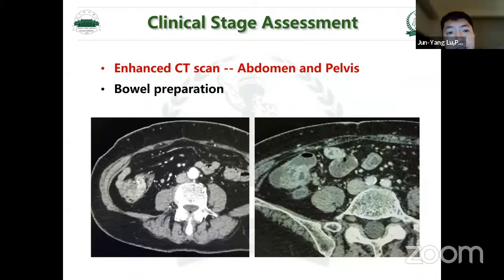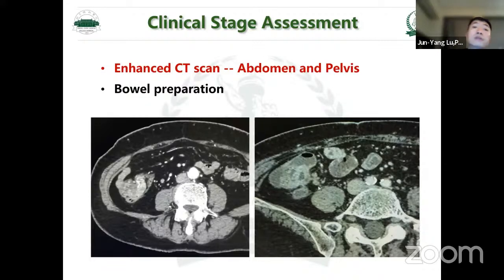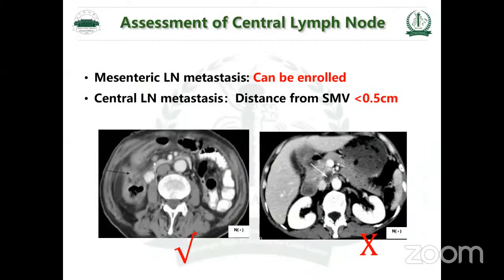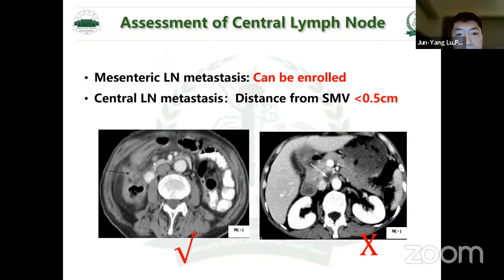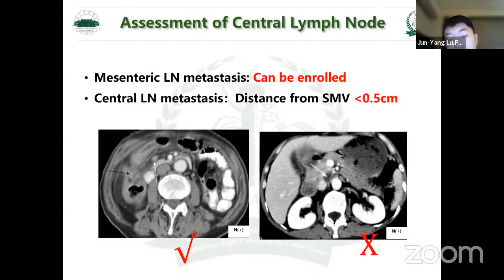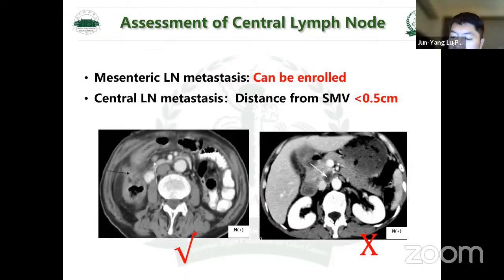The enhanced CT scan of the abdomen and pelvis is performed before operation, to determine the clinical stage, the depth of tumor infiltration and the status of the lymph nodes. Patients with distant metastasis were not enrolled, and the patients with central lymph node metastasis were excluded. We define the central lymph node as a lymph node with distance from the SMV of less than 0.5 centimeter.